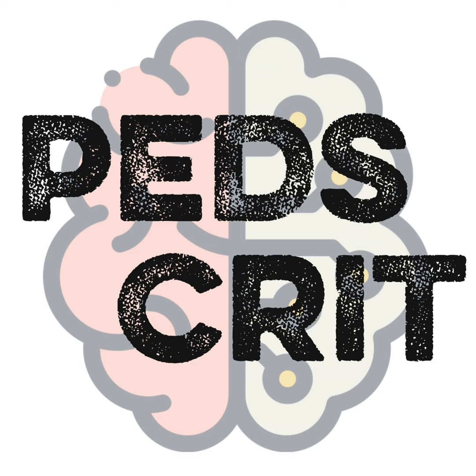So in the PICU, all the cannulations are done by our general surgeons, and our general surgeons typically do not repair the vessels. They are tied off, and given the risk of stroke, the vessels are not repaired. Whereas in a cardiac ICU, the vessels are repaired. And I truly don't know what the evidence is supporting either, but cardiothoracic surgeons recannulate because the cardiac population is somewhat different, right? There's always this question that they need them for the surgeries and always like to keep all the vessels open. So they do reconstruct.